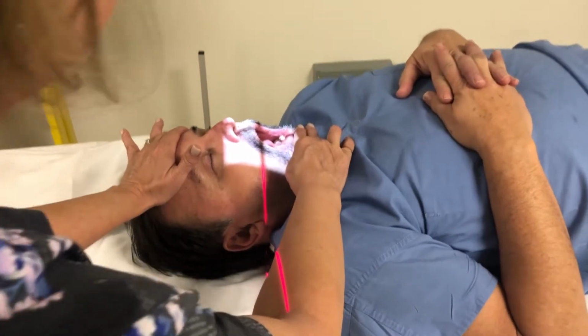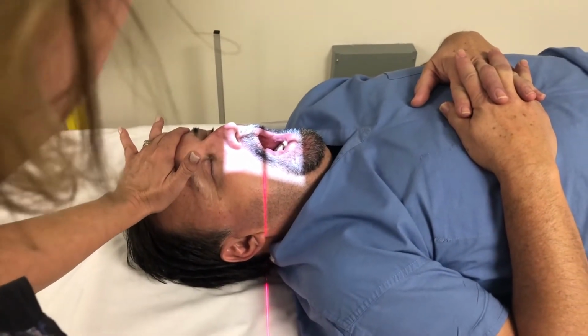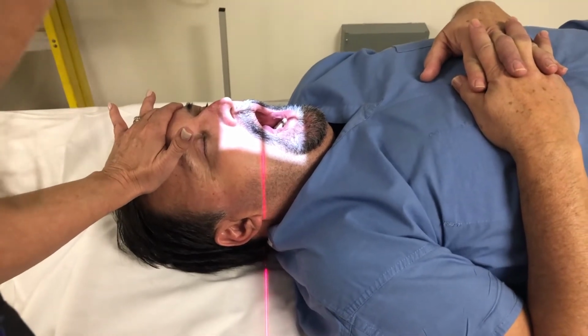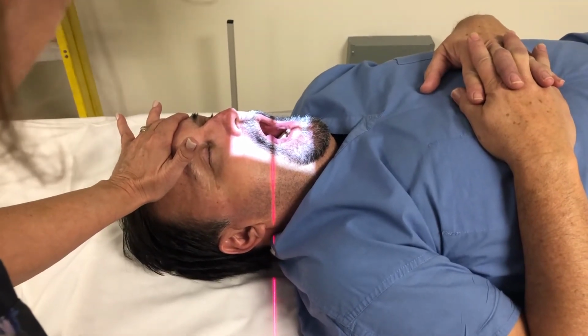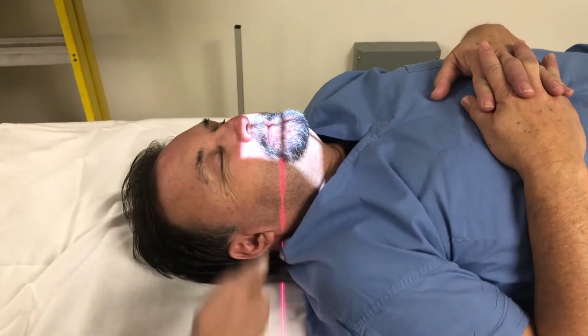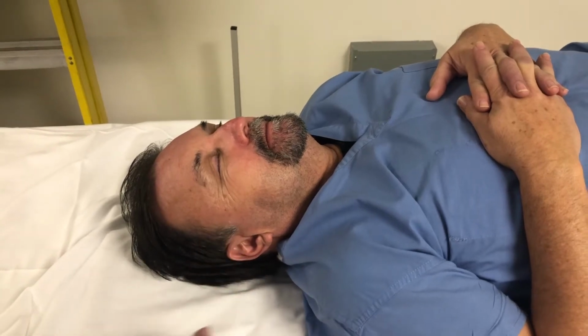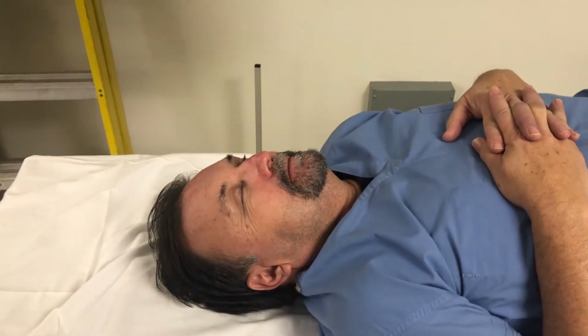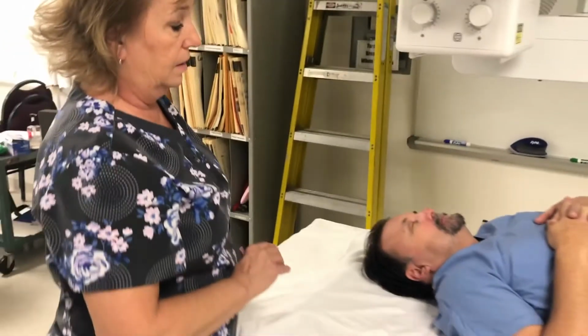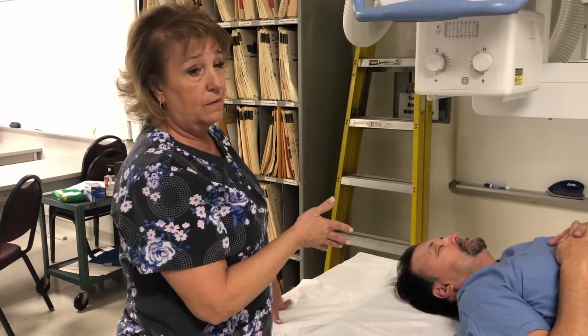And now I'm going to see his atlas and axis centered in the center of his open mouth. So I'm centering to the center of his open mouth. Okay, you can relax. But his occlusal plane is what's perpendicular. Read over this section in your textbook for a little bit more detail. And as you can see, that's not an easy position for a patient to maintain for any length of time.